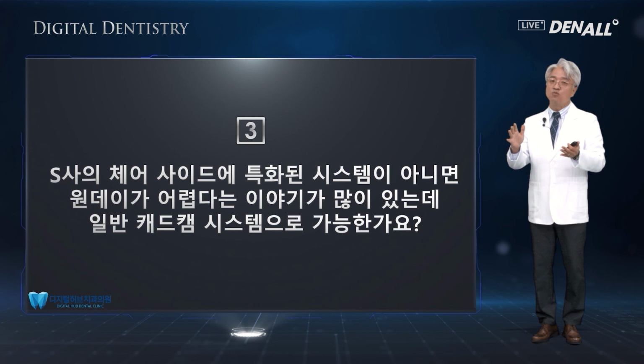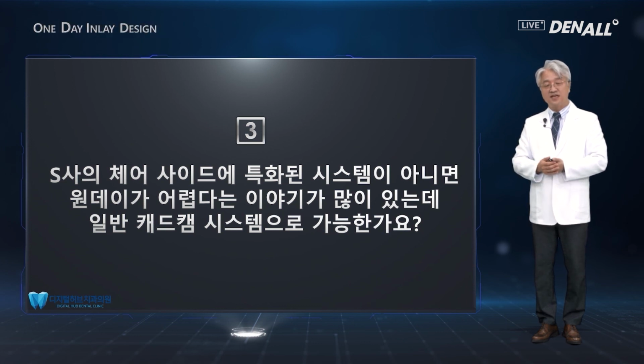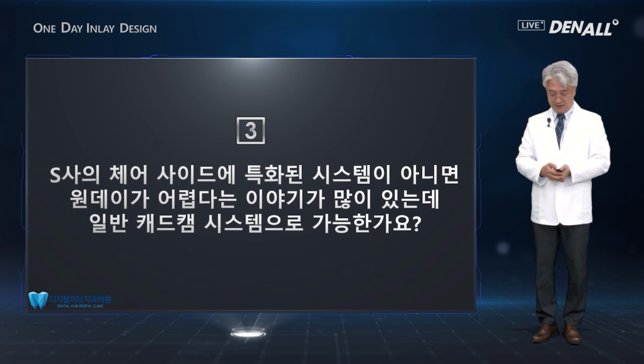So a lot of constraint has now been overcome, and all these are now available at your clinical setting. So without this customized system with the general CAD/CAM system, I believe one-day approach is now possible.